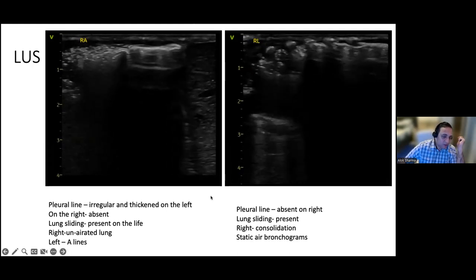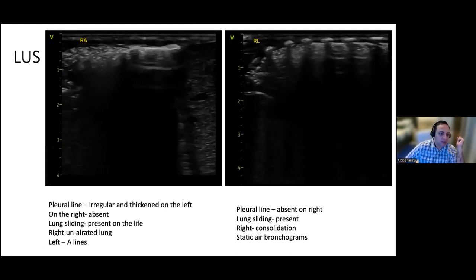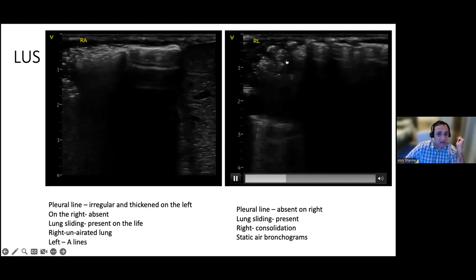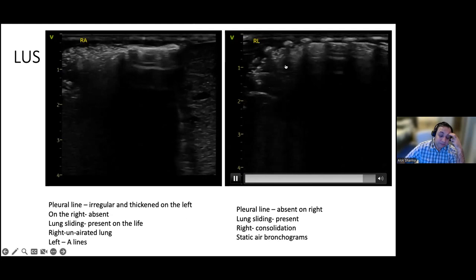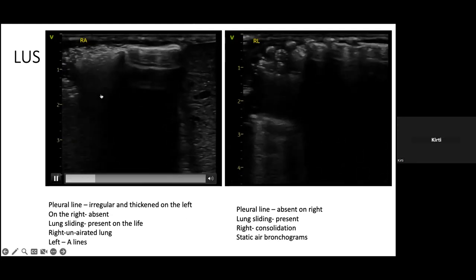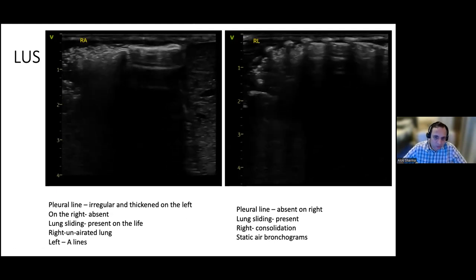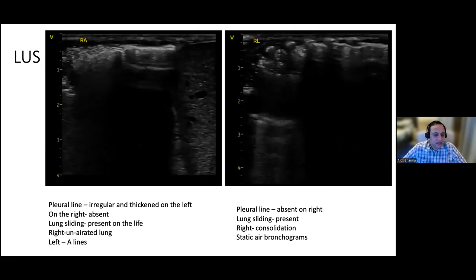The fact that you have no established pleural line with a tissue sign again raises the possibility of an atelectasis. And I think what you've got there in the right lateral is very clear. I cannot see any pleural line at all. This was just from a case early on where I don't have enough gain. That's all right. That's beautiful. So again, it's to say to everybody that you can make interpretations. You've got static air bronchograms within that with no pleural line, with what looks like a tissue sign with aerated lung below that. It's absolutely beautiful.